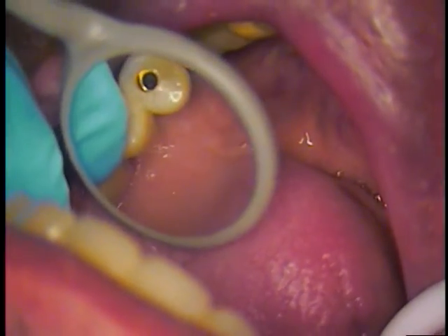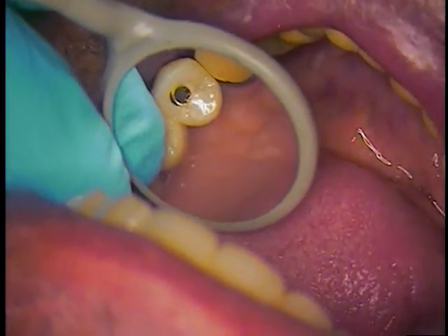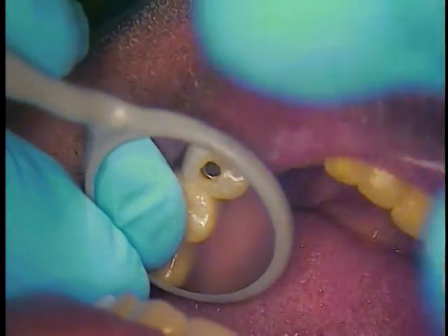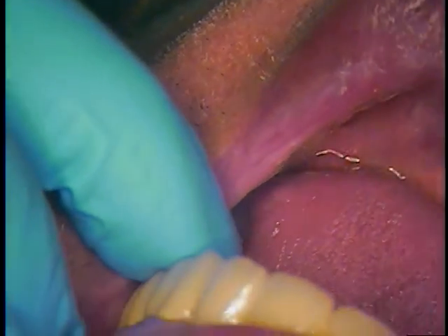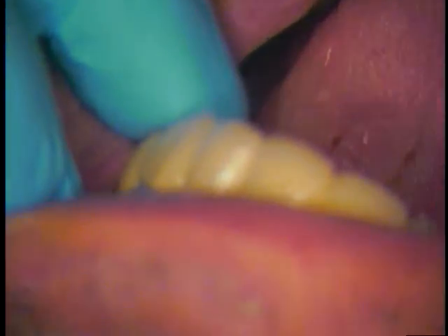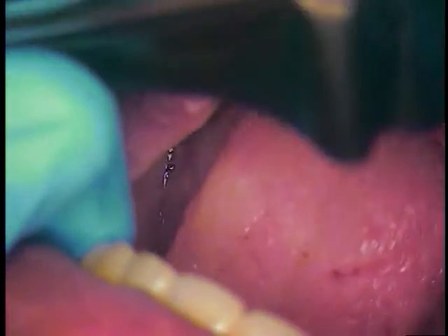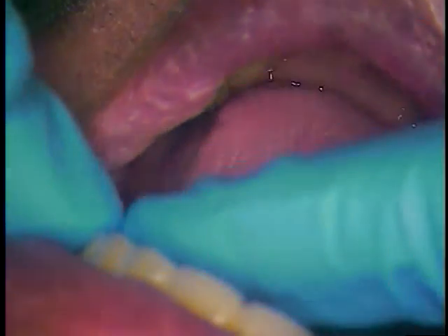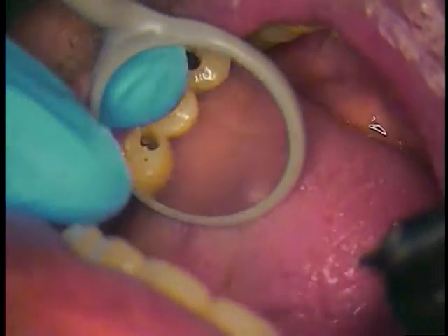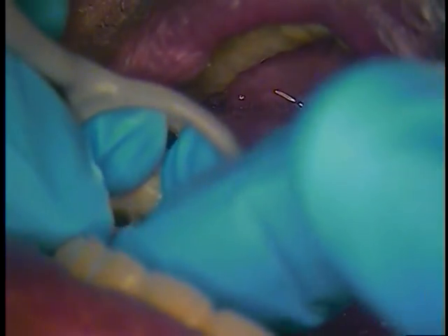The last thing we want to do is check occlusion. So very gently, we're going to put the thin paper in, just very gently. Make sure this is in the middle of our view. The color is a little different on the viewfinder here because we didn't color correct this image — if it shows a little yellow on the image, don't worry about it; it's not in the mouth. So just a gentle closure here, please — tap, tap, tap. We know we made some nice marks on it. We're going to be adjusting those after I'm done.